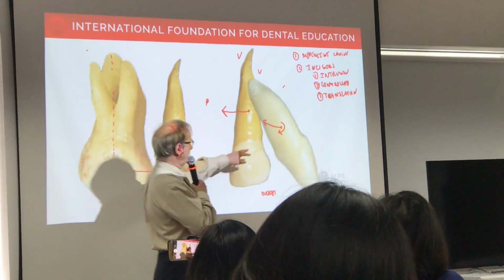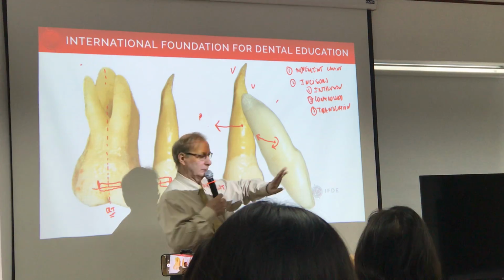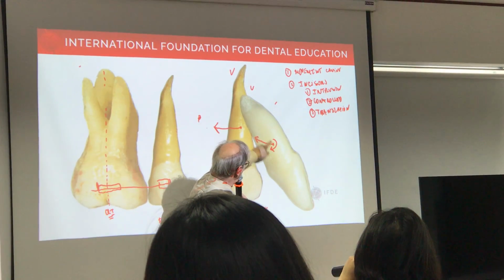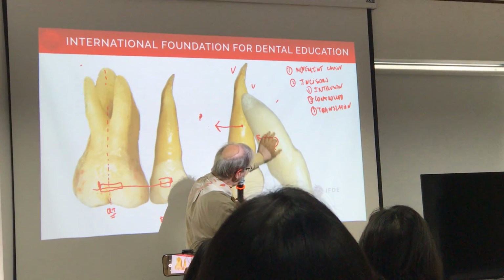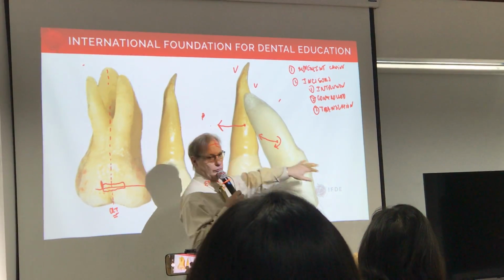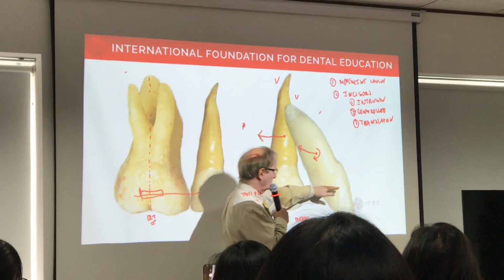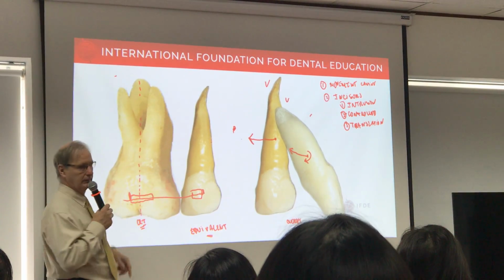And we practiced this yesterday. It requires a very light force, intrusive force. So you're going to say, okay, I want this tooth from here to here. So this is the line of action of the force, and I want to rotate it. So I'm going to put a little bit of a torque on it, or I can use an intrusion arch, whatever it is. Then you bring it here. So the anchorage requirement is not so bad.